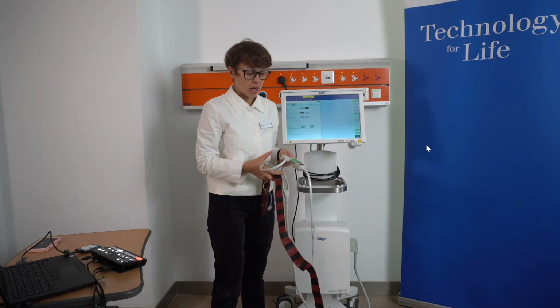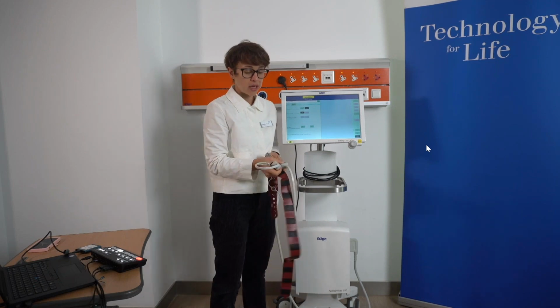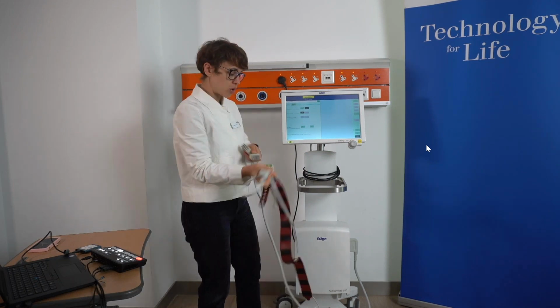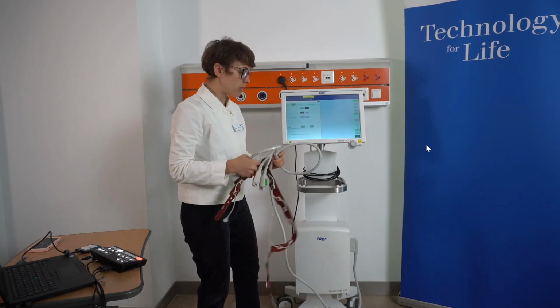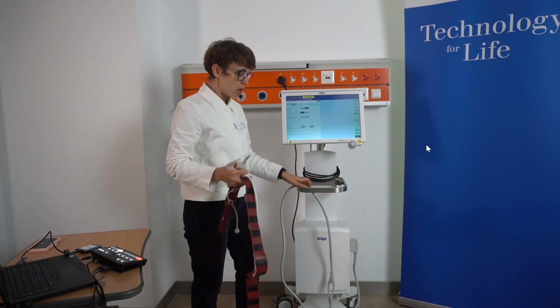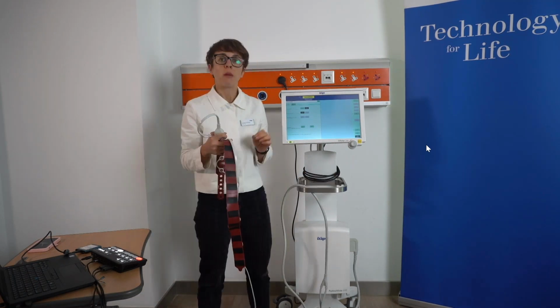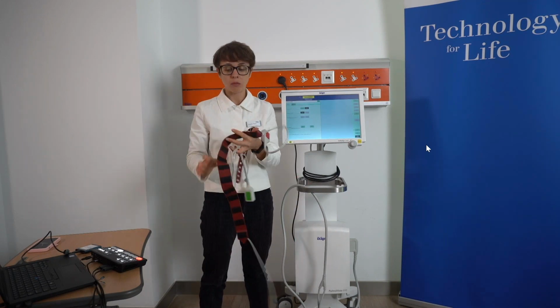But I would like to share with you a few practical tips on how to best prepare PulmoVista for use in the ICU. I would not recommend connecting the cables right away, because the cable positioning can be quite challenging.